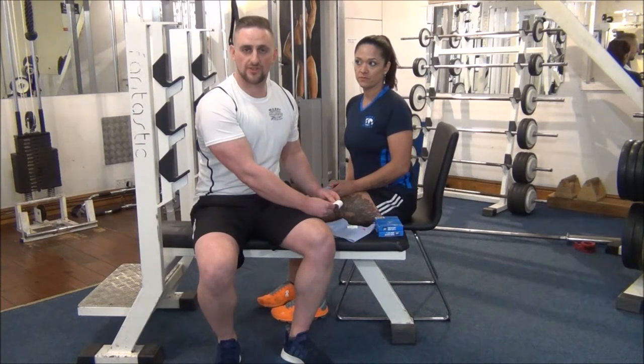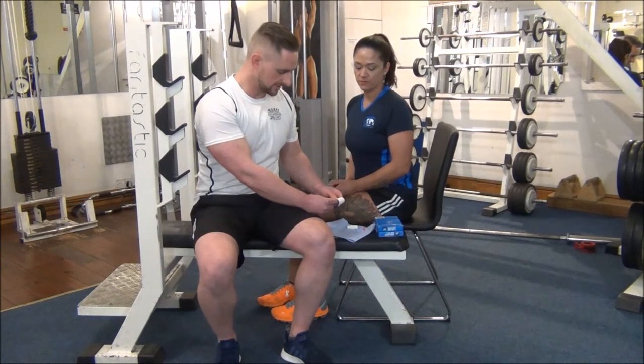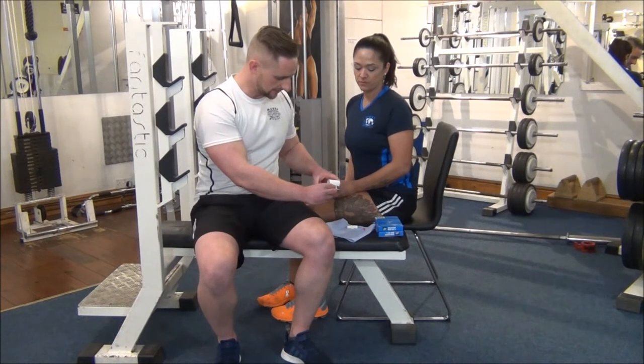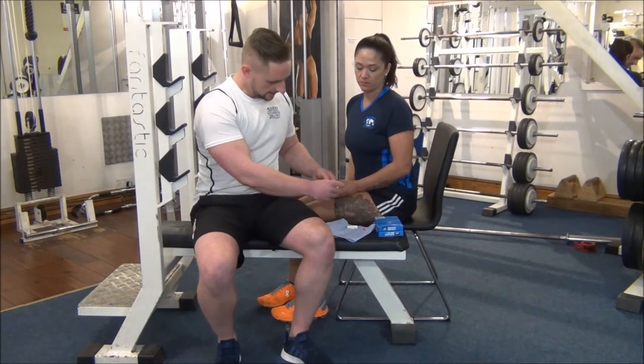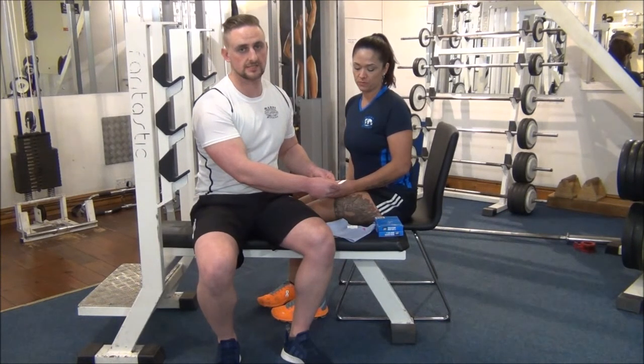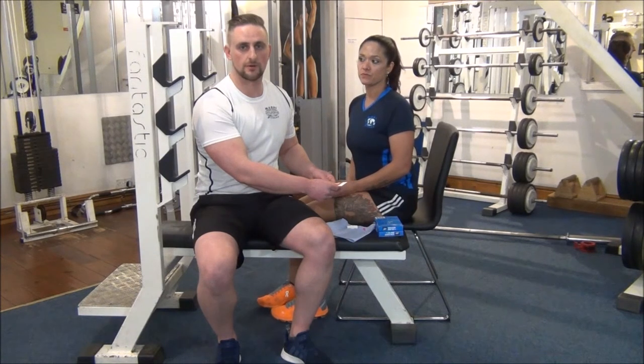We've just gone over three minutes there, so now we're going to look at Jess' results. We can actually see by looking at the strip here that we've got a reading of 4.6 for Jess. We're going to make a note of that on the fitness assessments that we've got for Jess, and then we'll recheck it again in about four to six weeks.